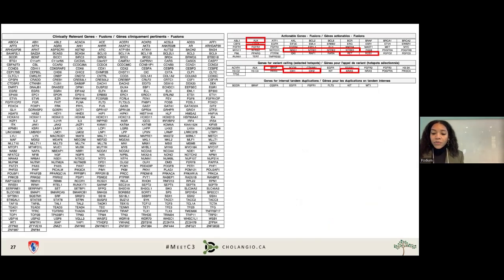This is the repertoire that we had up until April 3rd, actually. So as of yesterday, we went from 550-ish genes that we would standardly report to about 1,300. But most of them are relevant for sarcomas and not so much for our topic today. So I've highlighted in red boxes the clinically relevant alterations for the cholangiocarcinoma that Dr. Feilotter mentioned, which we still have in the new repertoire and can test for.